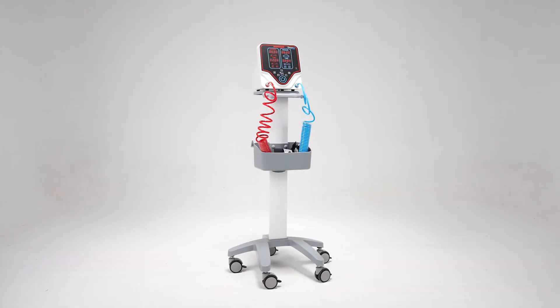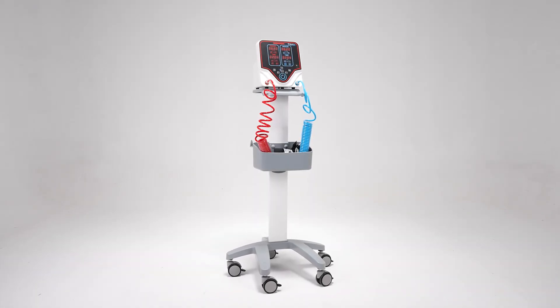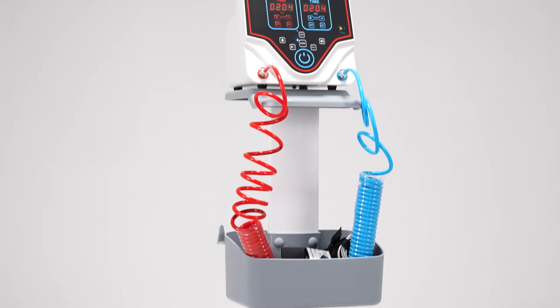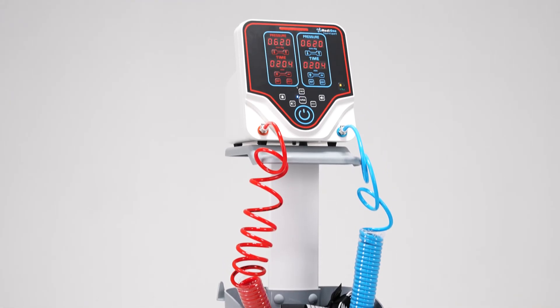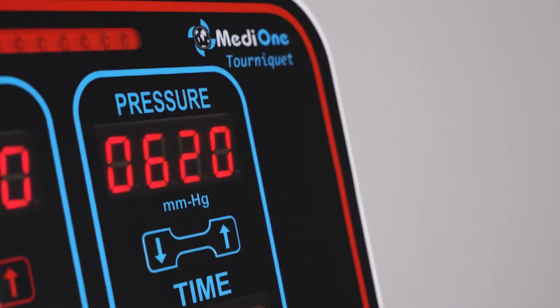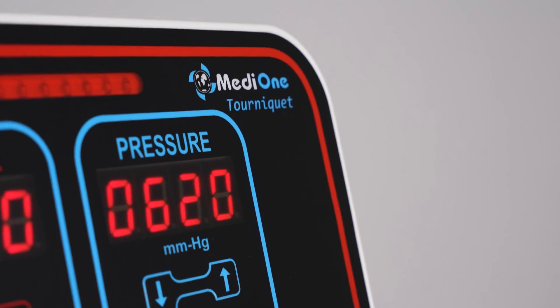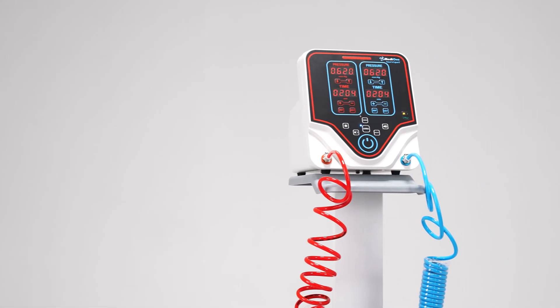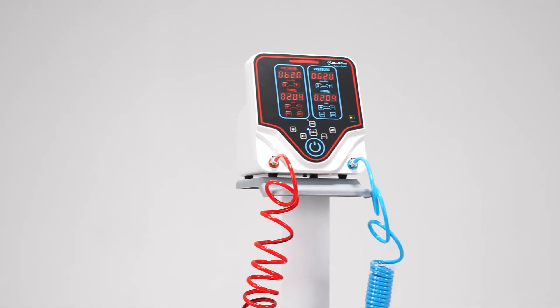Hello, I would like to introduce you to the MediOne TRQ 2020 Automatic Tourniquet Device. Automatic tourniquet devices are used to stop the blood flow in a limb by creating external pressure on the limbs through the cuffs, and thus to perform surgical applications without blood loss.